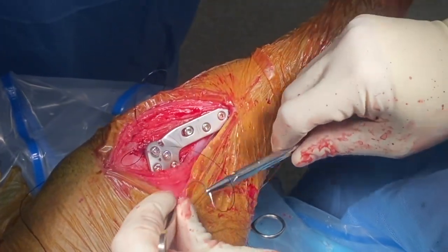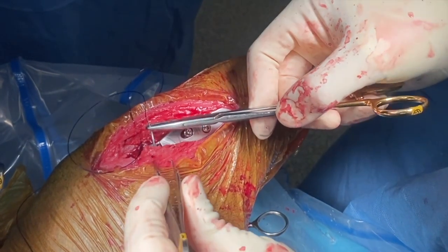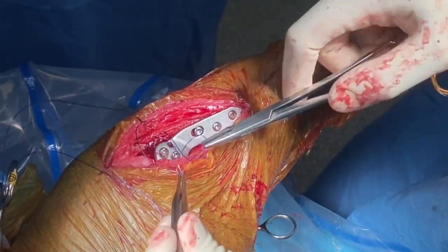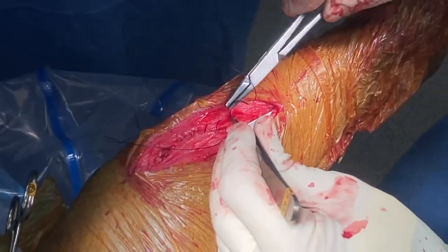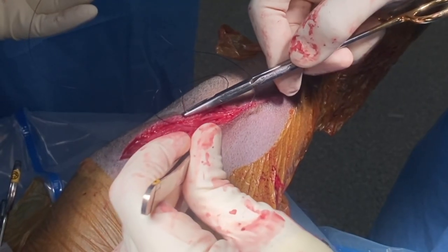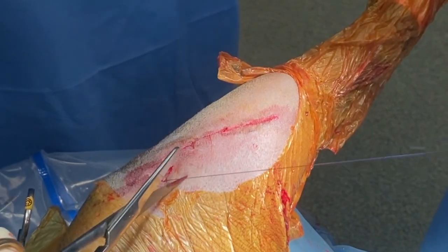After lavage and final check, the fascia is closed. I prefer to start proximally with a cruciate suture. It is important to identify and engage the fascia on both sides of the closure. All knots are buried from this point. The skin and subcutaneous tissues are carefully closed. Intradermal sutures are used in this case; skin sutures are acceptable but staples should be avoided.